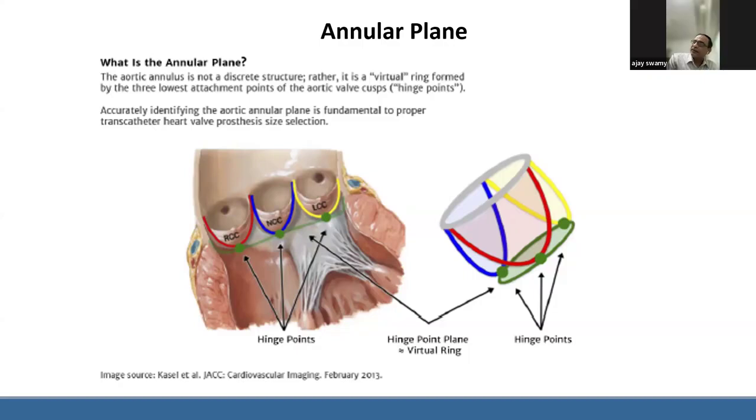I think there is so much learning that this part has really got kind of missed. We just get the CT and then we put it onto the 3mensio and start playing video games with the images. But I find it very interesting.